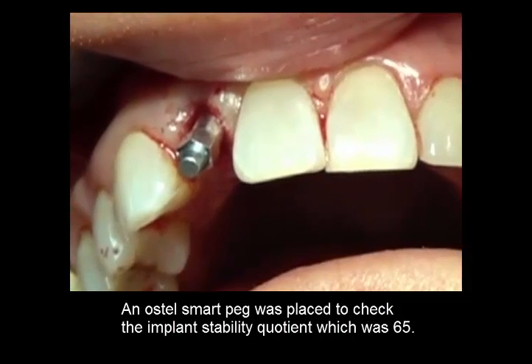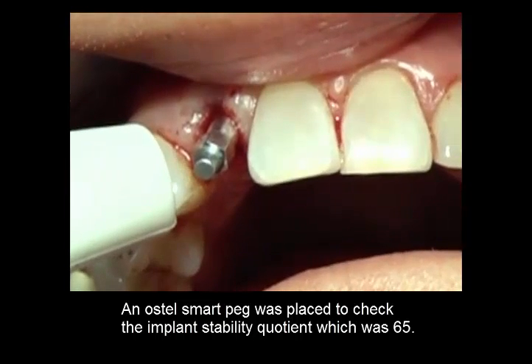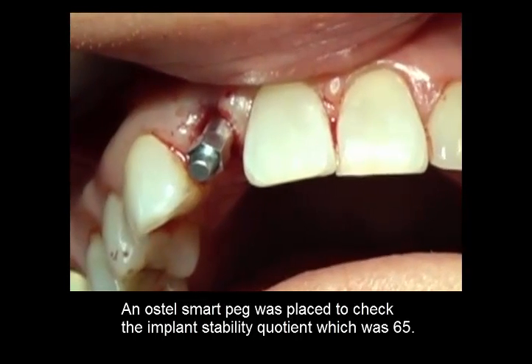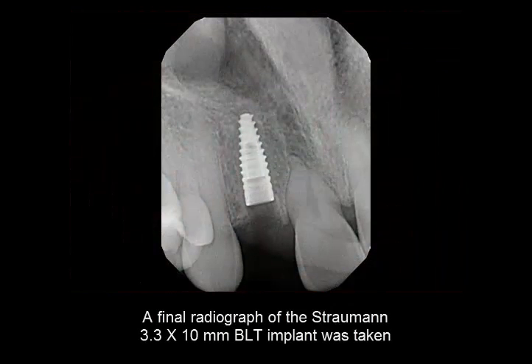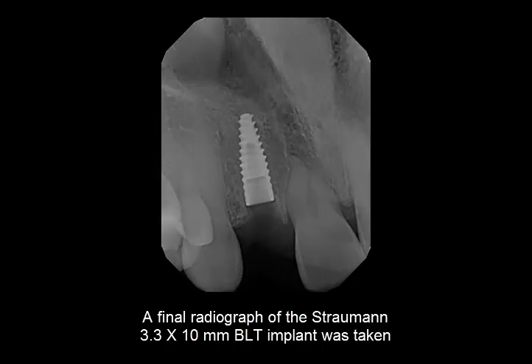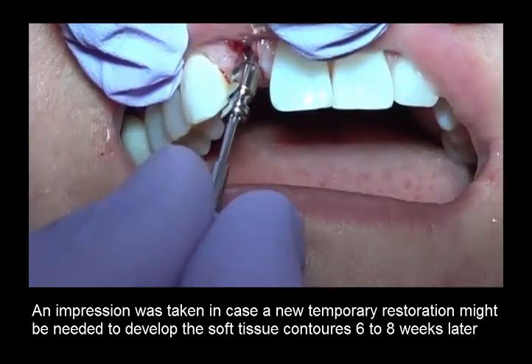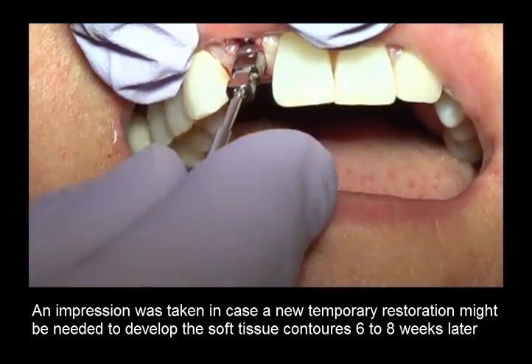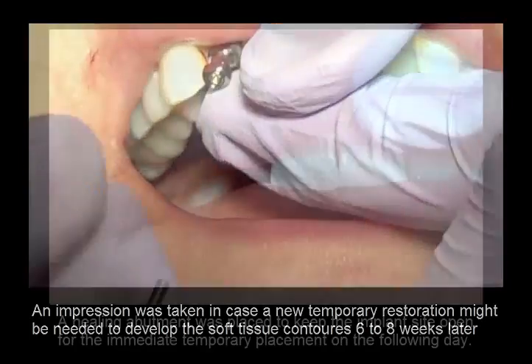An Osstell smart peg was placed to check the implant stability quotient, which was 65. A periapical x-ray was taken of the Straumann implant after placement. An impression was taken in case a new temporary restoration might be needed to develop the soft tissue contours 6 to 8 weeks later.